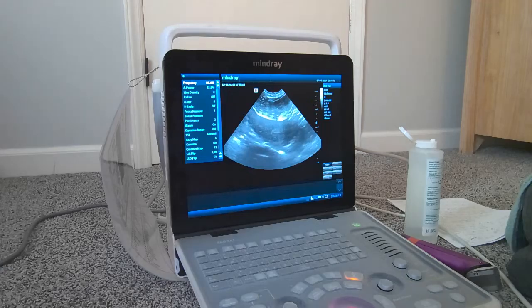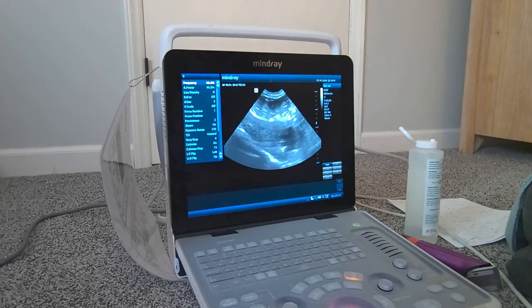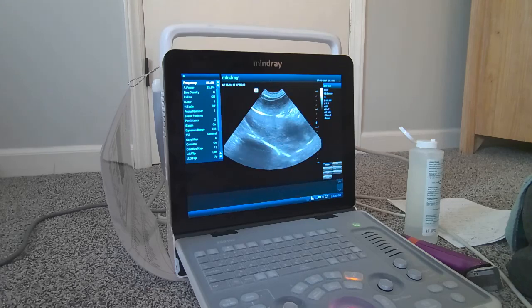Hey everybody. So today I want to look at some of our liver and gallbladder structures when we're doing an ultrasound. A big thing to think about first is making sure we image everything that we need to see. We've mentioned before that we can change our depth and our frequency, making sure we're seeing the entire organ and not missing any little areas, because it really stinks when you do a full scan and you miss some bad nodules or a mass all the way in the back of the liver somewhere.